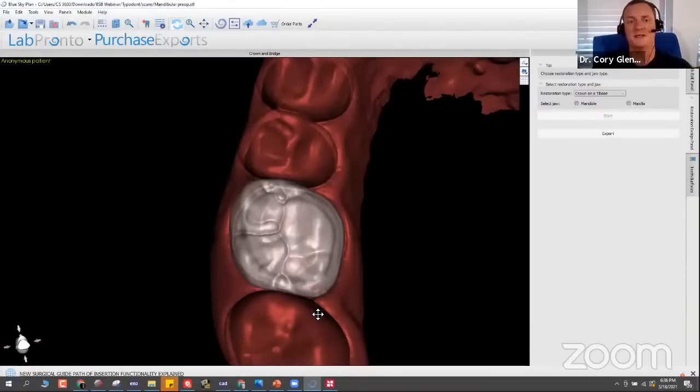I would recommend using a resin cement to truly bond these, because otherwise, if you're using just a conventional cement, they're not really a super hard material like, say, a zirconia crown that can deal with that. They potentially could flex a little bit. At least I'm saying that based on other composite-like materials that I've used in the past. So they really do need to be bonded.